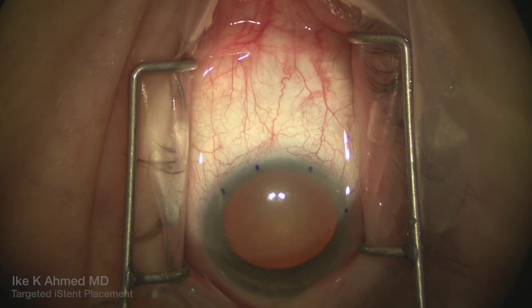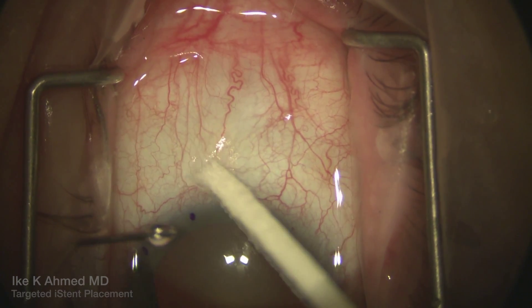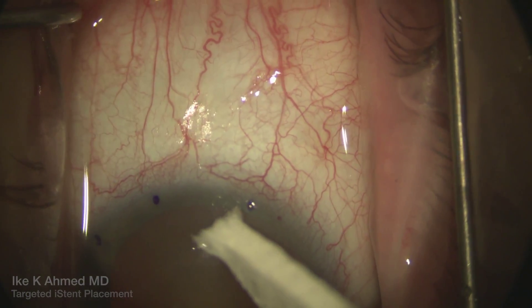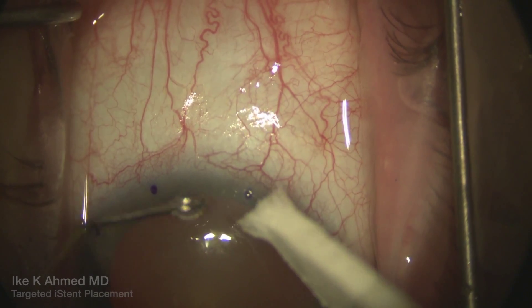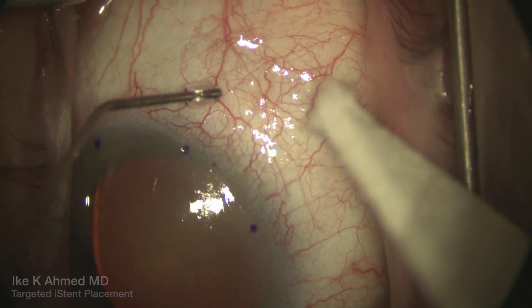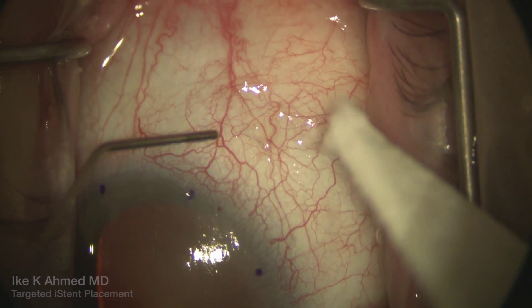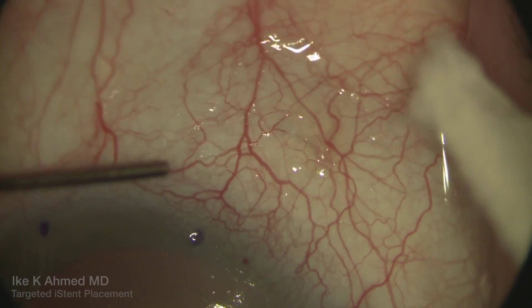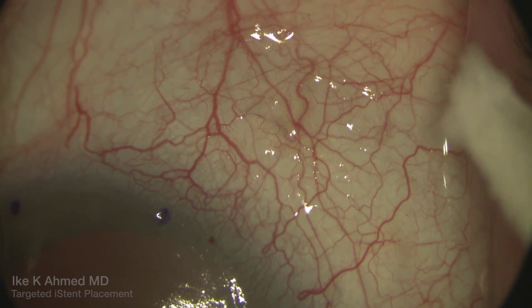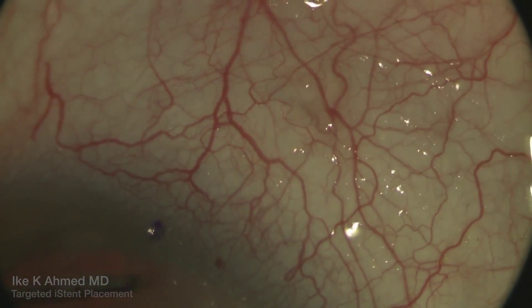We're going to inject some BSS in the anterior chamber to further increase the intraocular pressure temporarily. What we'll see is some blanching of those conjunctival veins as well as the episcleral veins. The aqueous veins — larger caliber coming right off the canal — are quite nicely shown, particularly in the supranasal area where we see this tangential vein pulsating as it meets up with another episcleral vessel. This pulsatile flow is well-recognized as a mechanism of normal physiologic outflow.